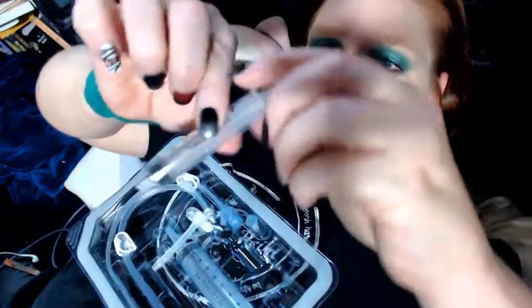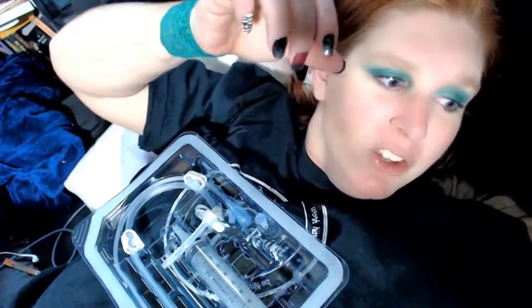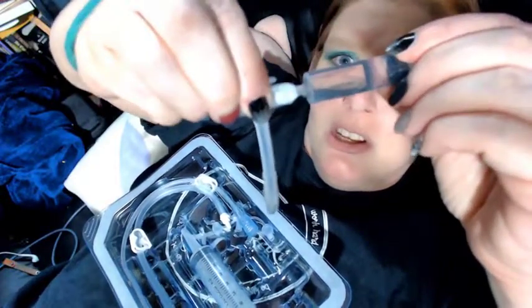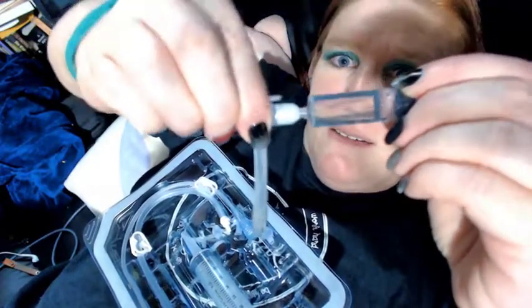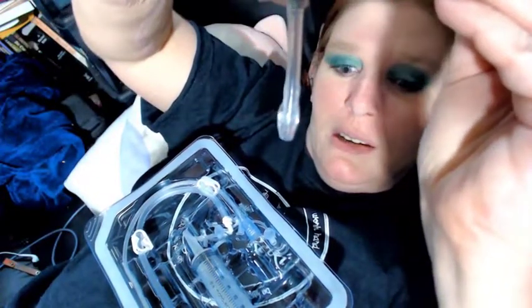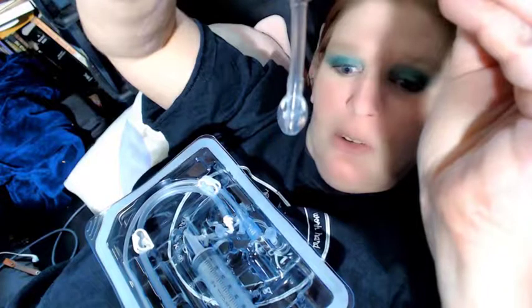This syringe is where I put the water that has to go into the tube. So let me go ahead and do that. And I'm going to show you what it will look like inside my stomach. So you put the syringe right here on that part, and then just push the water in. And you see it filling up like a balloon.